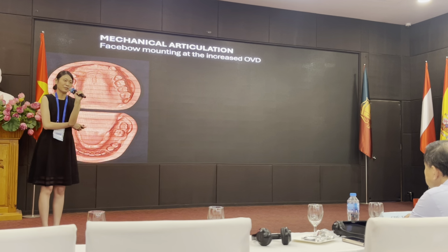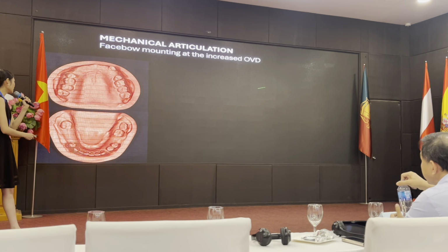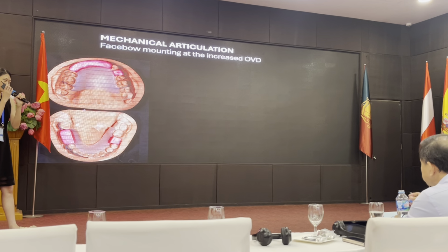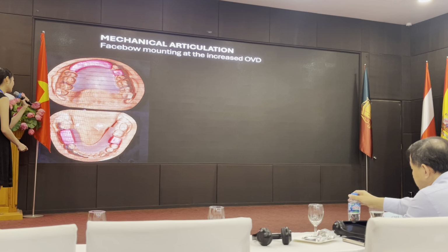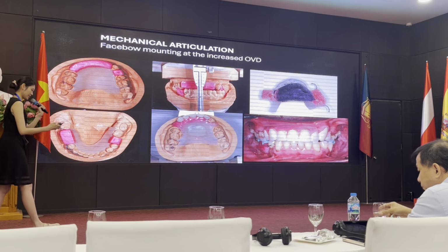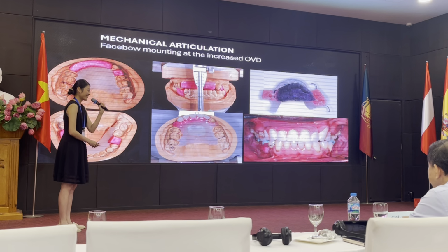And then before I jumped into dental surgery, I still went back to the treatment planning carefully to discuss with the patient. So I got the diagnostic cast. And the second thing I did was I evaluated the patient's overjet and overbite and determined the ideal vertical dimension that I want to restore. So I made the wax rim. And this is pre-made in the lab. And then I set up the teeth chairside to get the ideal occlusion for aesthetics.